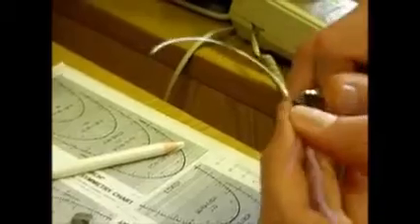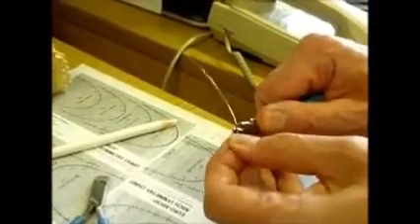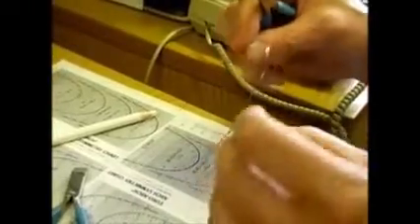So that's nearly there. And then these are not, so you've got to just flatten the wire out so that, provided these bits are level, we need to get it to look like that. Is it more or less level? The negative torque. Yeah, so it just goes up, and there might be a little bit of torque left in that side. So let me just increase that.